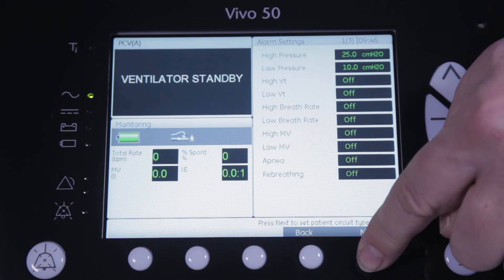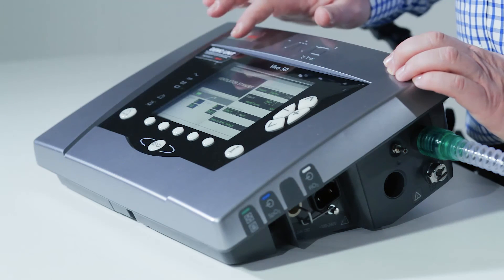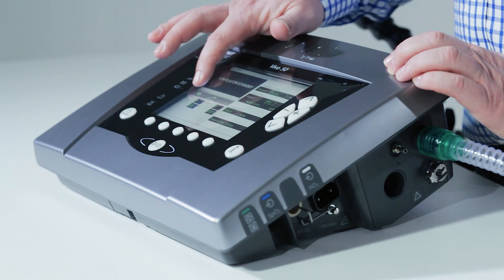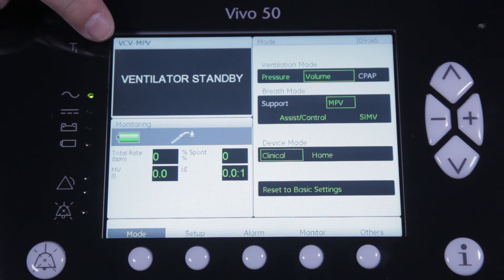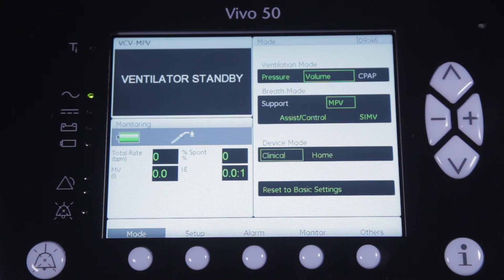All we have to do now is press next and the Vivo is ready to be used in volume controlled MPV. As you can see, the ventilator shows VCV MPV as ventilation mode and has changed the icon of the circuit type to a circuit with an angled mouthpiece as used during MPV.